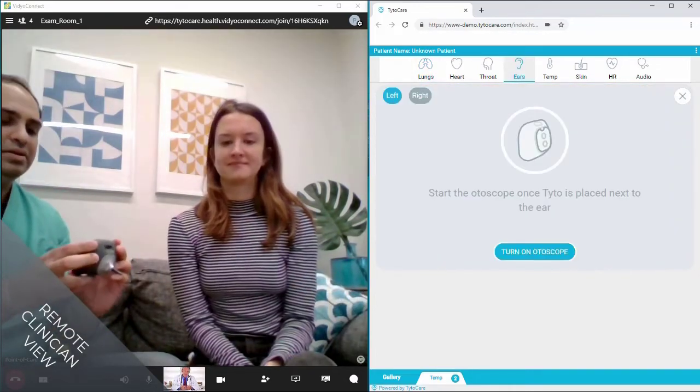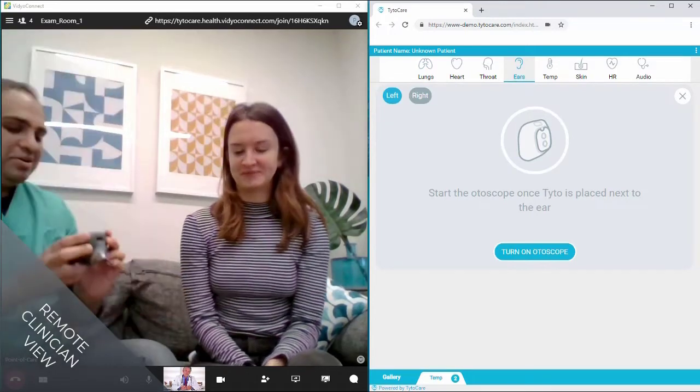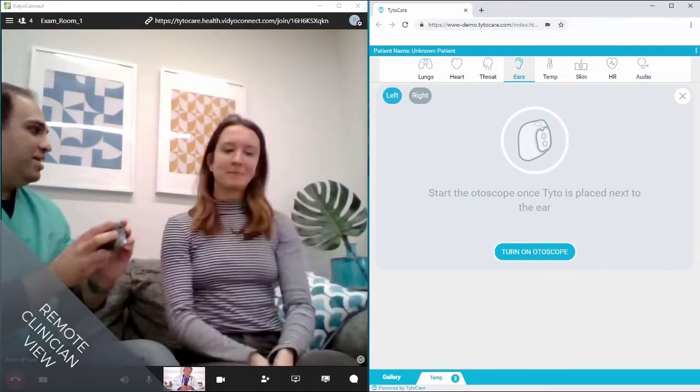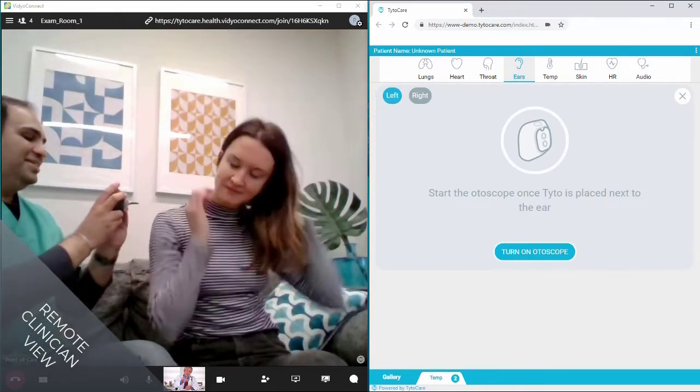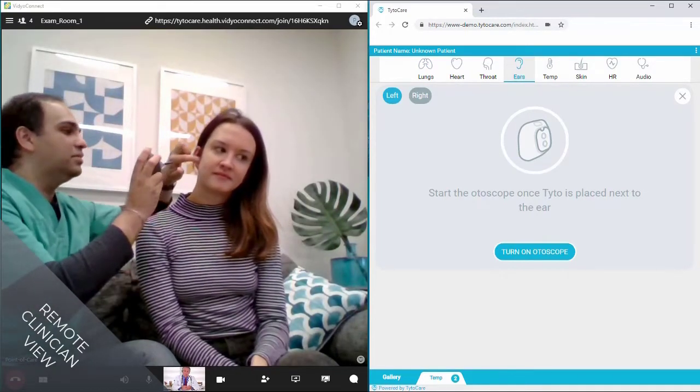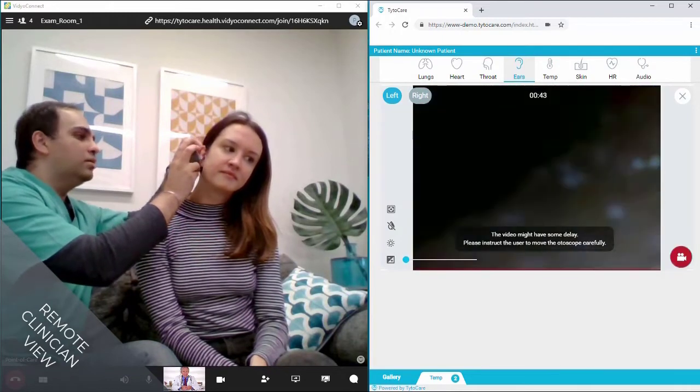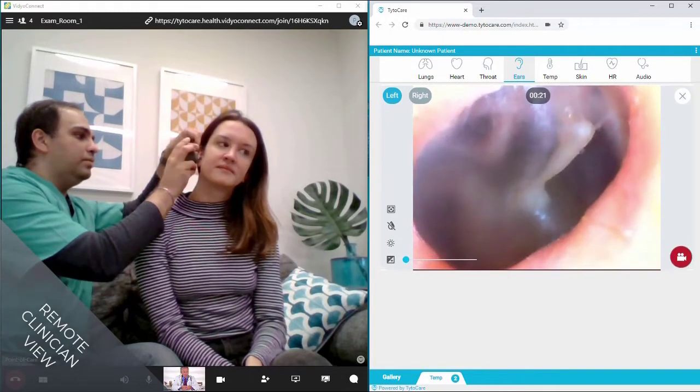For example, for a patient reporting ear pain, the point-of-care provider can perform a live ear exam with the otoscope while the remote clinician drives the exam and views the exam feed in real-time.